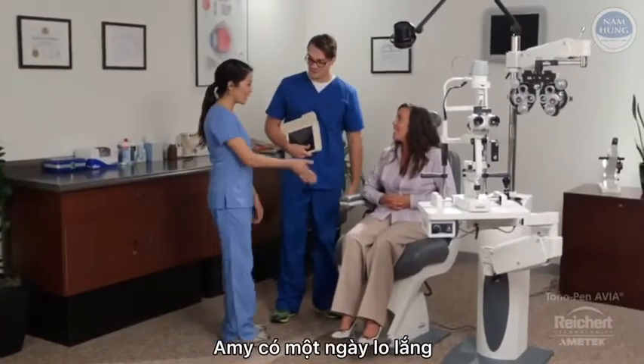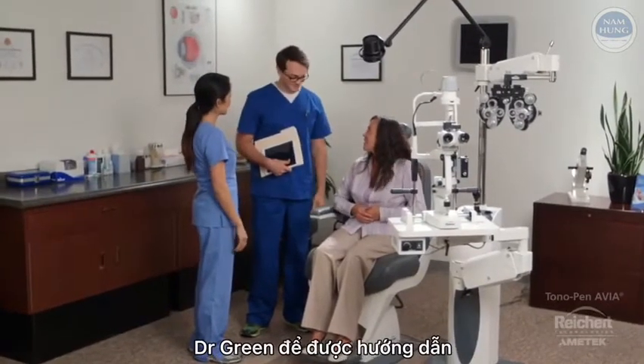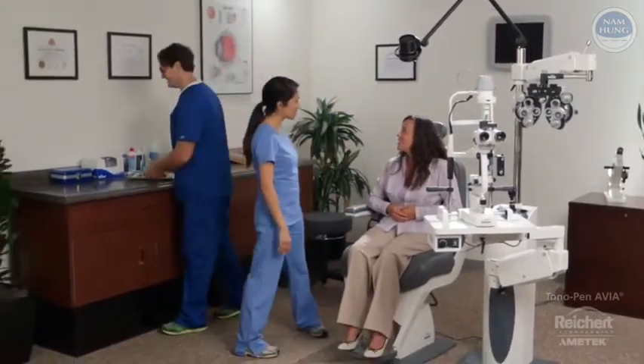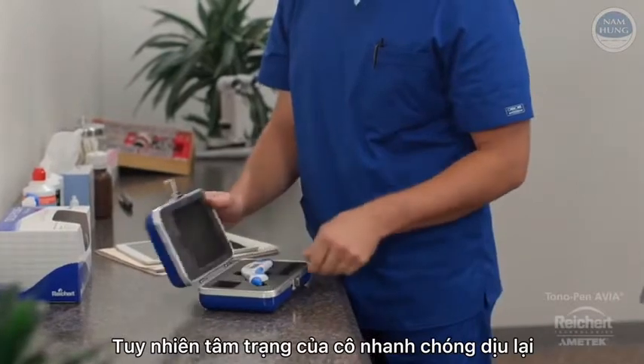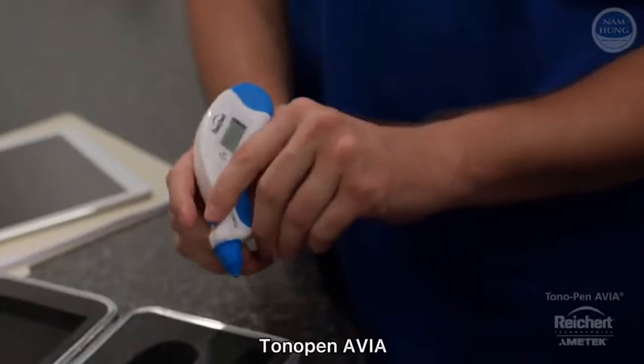Amy is having first day jitters. She's just started at Dr. Green's practice, getting on-the-job training, and she's feeling a bit overwhelmed. However, her nerves quickly begin to subside as Eric starts to demonstrate how to use Rikertt's Tonopan Avia.